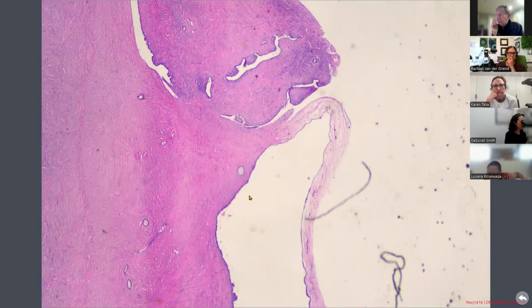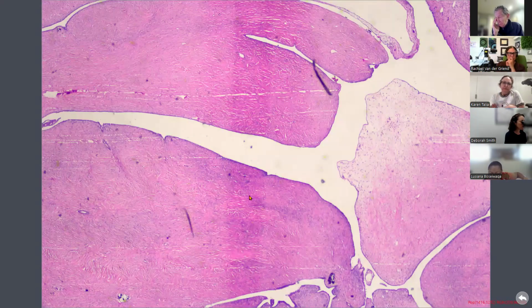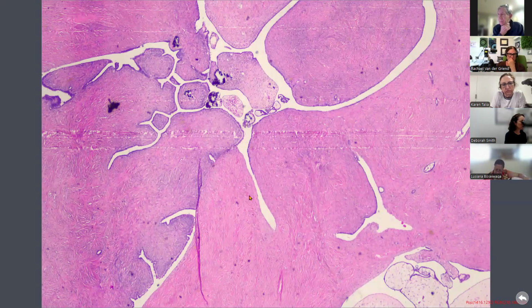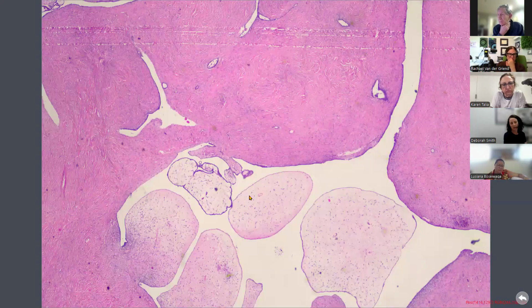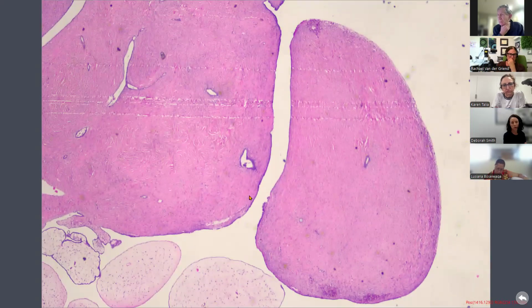This is completely flicking into a different place. This is another 30-year-old, and this is an ovarian tumor. Look at the right slide here. This came up as a discussion of at what point do you go from being a benign serous to a serous borderline, and what are the rules around that. We'd called it benign on frozen. As you can see, it's very bland looking. It's very papillary. It's actually quite hard to see because it's so big.